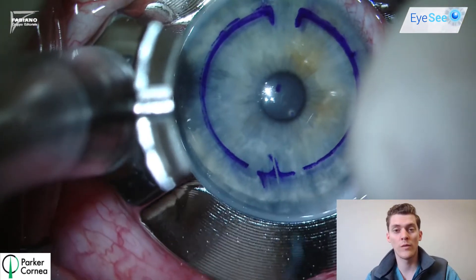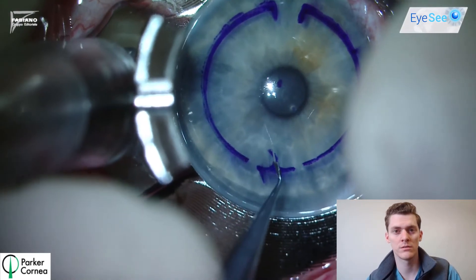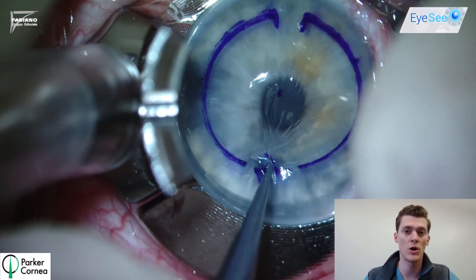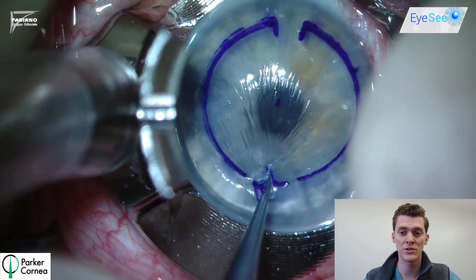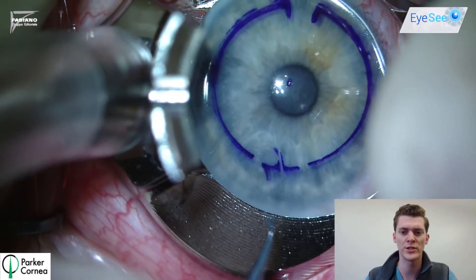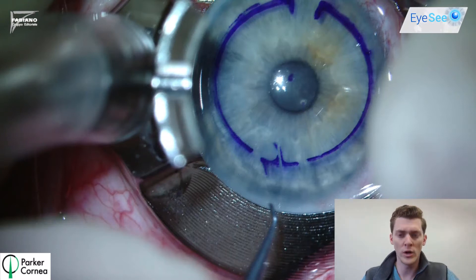As you can see, we've already marked the cornea, made the radial incision, and applied suction. Our next step is to open up a small stromal pocket using what we call the long Sinskey hook. During this process we see an outpouring of aqueous onto the corneal surface indicating a perforation. So the first thing we need to do is stop and decide: should we abort the case or continue going?